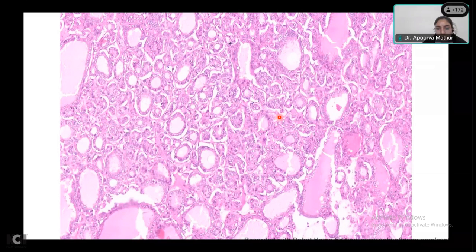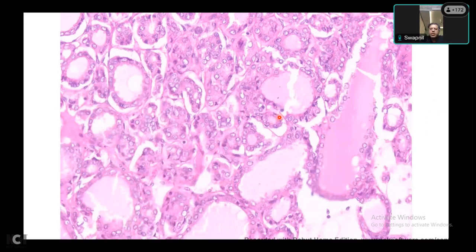So that's the rule. Most of these diagnoses are morphology based and not really IHC based or based on any other features. So now, in this case, there are obviously nuclear features of PTC, like the clearing and irregularity, and I think some grooving as well.